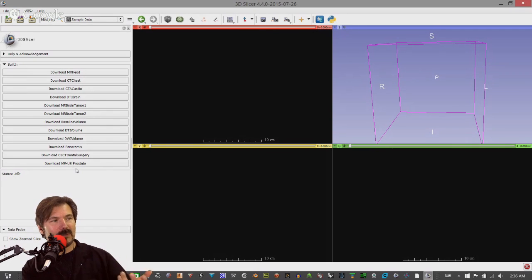In fact, I explored it about a year ago, and I was able to take a 30-day GE variant and kind of fool it into believing that I had a server, and was able to bring in some ultrasonic information of a fetus, and was able to print it. So it was a pretty cool process. But sadly, GE kind of keeps a lock on that particular ultrasonic 3D information, so it's still not available to anybody outside their own format.